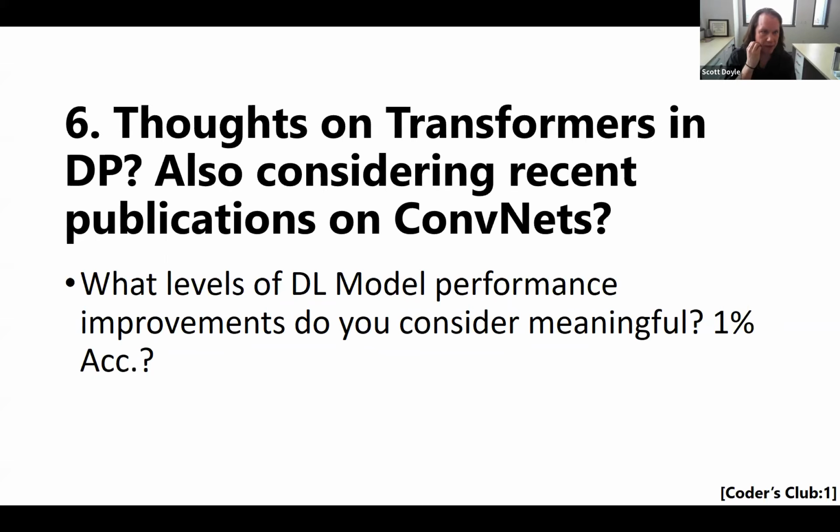The reality is that risk is associated with making the right decision if it's a probabilistic classifier. We should probably start talking about that with a little more nuance when we talk about performance: what exactly are we referring to, and what are we classifying more accurately, precisely, or specifically?